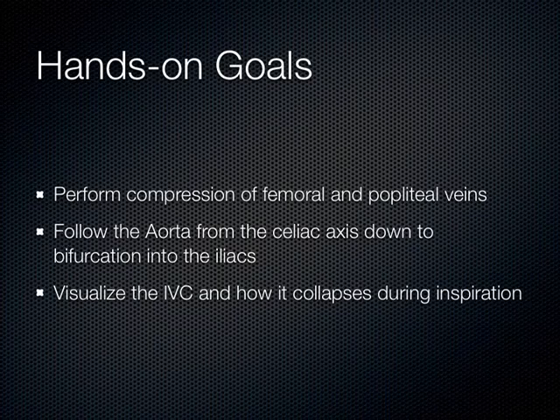That's about it. If you want to move on, ask other questions, you have time left in your group, by all means, scan whatever you want today. Use it as kind of a free scanning session to tighten up wherever else you have questions, heart, whatever it is you want to do. But really today, it's the DVT, aorta, and IVC.